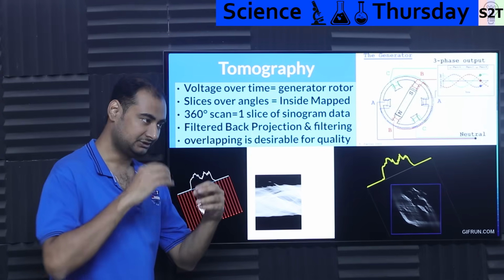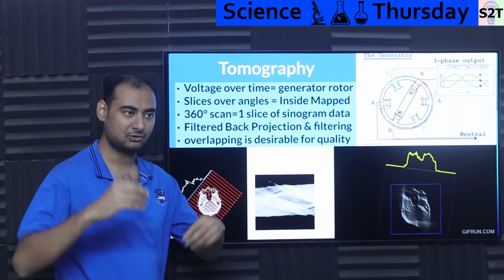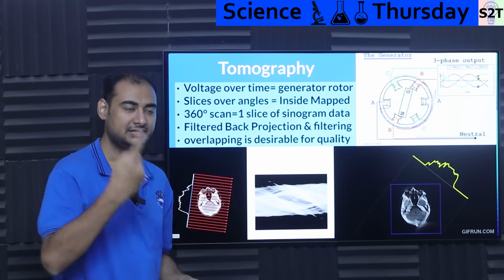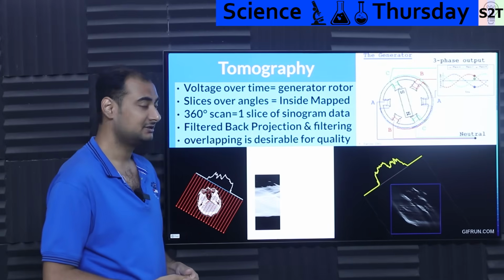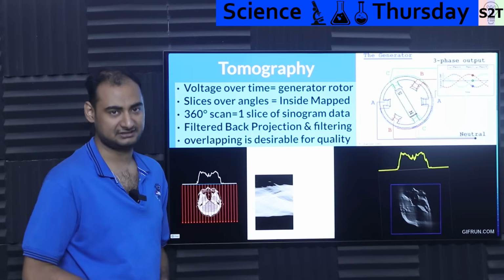Now, what is the output? You have the X-ray and you have the sensor block. What will you get out of it when you are spinning it like crazy? It could spin as high as 300 RPM. So that puppy is fast. So what do you get out of it? If you connect the data signal, what do you get?